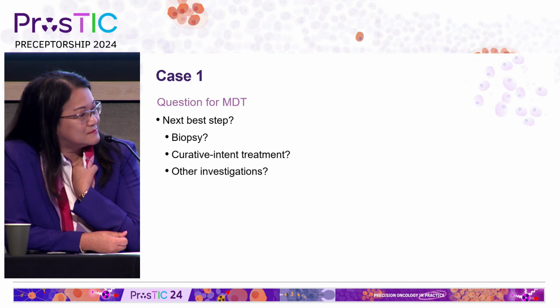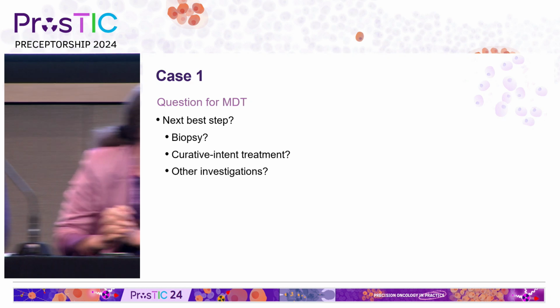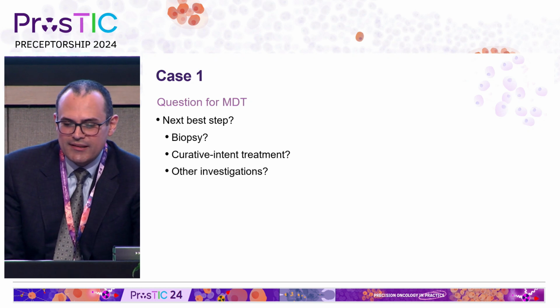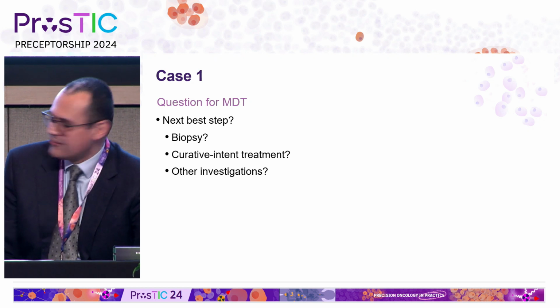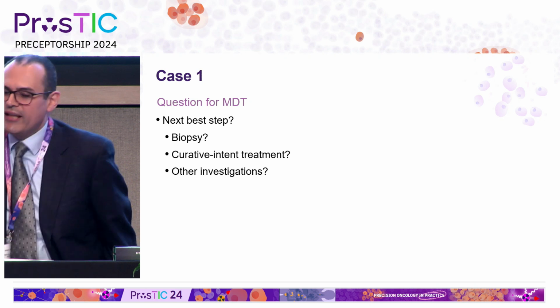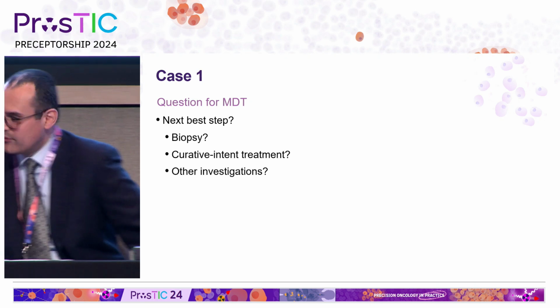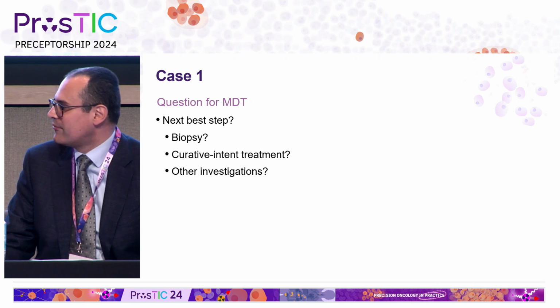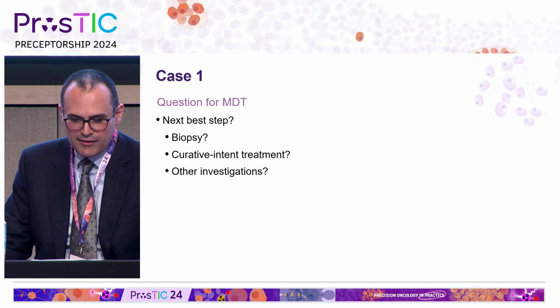Sydney, do you think that's a feasible thing to do from a radiology perspective? None on the CT. I don't know if there were any abnormalities in the inguinal, axillary or cervical regions, but certainly would love to biopsy something, but preferably not the mesentery.